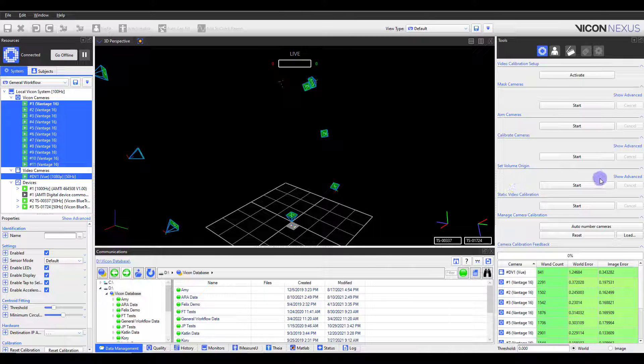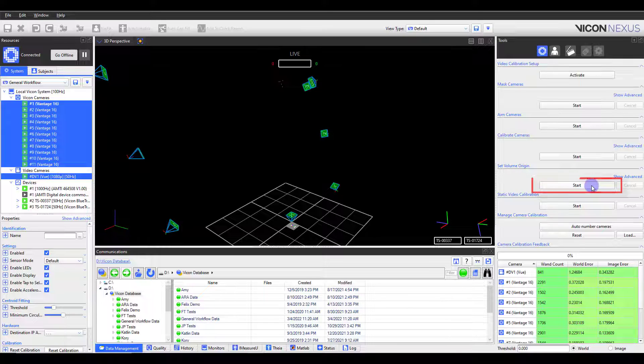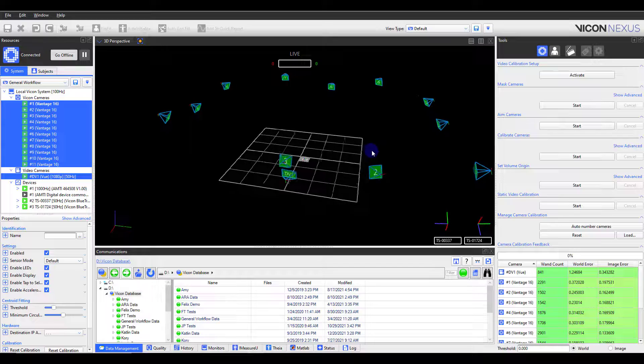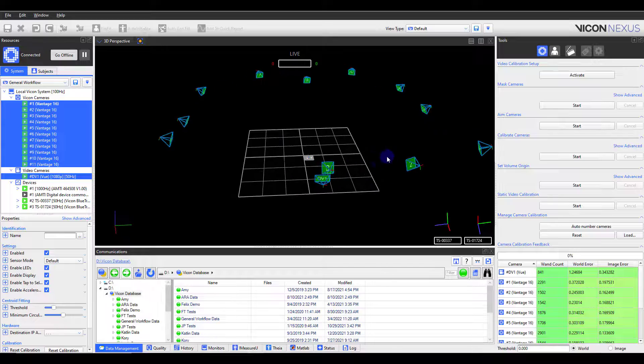Next, I need to set my origin to define my global coordinate system. Click Start under Set Volume Origin, then Set, and you will see the cameras snap into place.